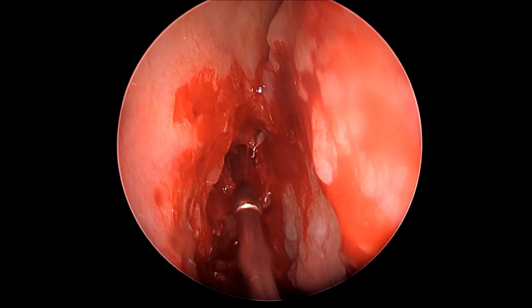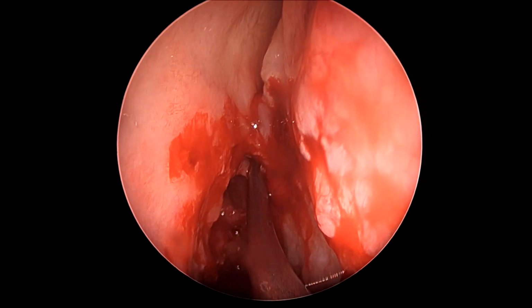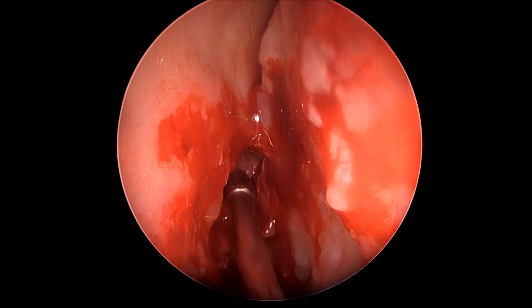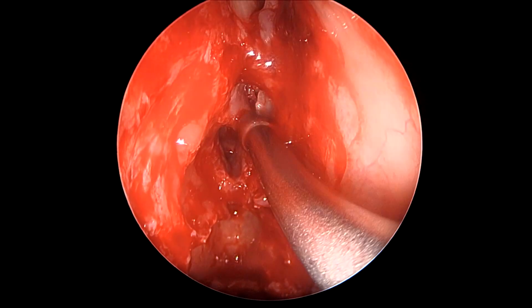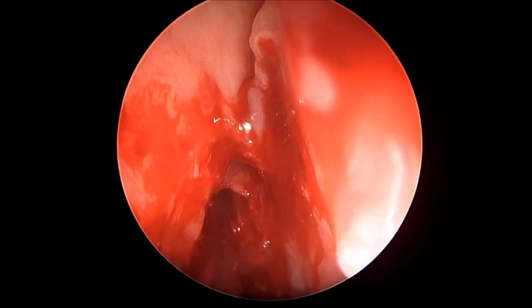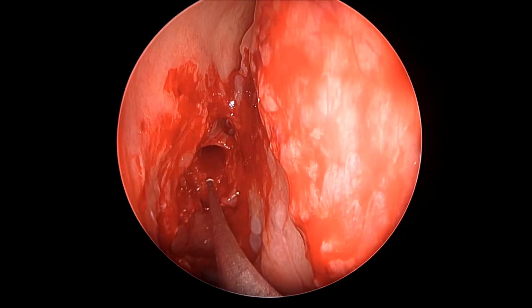And here you see anterior and medial to the frontal sinus, you see the interfrontal septal sinus cell, which has also been opened, and the suction can quite freely go. You can see a party wall between them that can be maintained because there's not much disease there. So you can see here how the anatomy is as seen from an angled telescope from below, something we had seen on the CT, the frontal sinus and the interfrontal septal sinus cell.